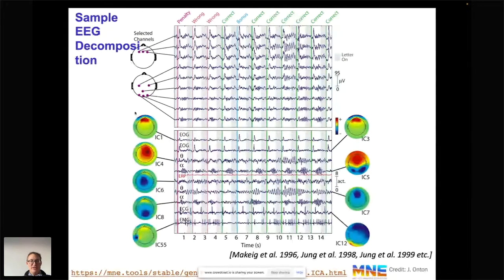This is a result that I assume was obtained with the so-called Infomax algorithm, where you can recover the latent sources, again completely in an unsupervised way, only using the independence assumption. You can recover and isolate the blinks, the EOG, which you see relates to the topography of the eyes. Here you have an alpha burst.